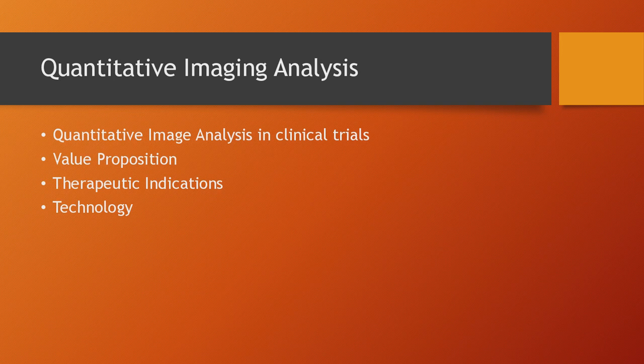So early treatment response changes are one of the indications for treatment response monitoring using imaging biomarkers, right? And also the evaluation, for example, of radiotherapy efficacy combined with chemotherapy is useful, right? Also treatments to stop brain degeneration or brain atrophy, and treatments for metabolic disorders like steatohepatitis. So the therapeutic indications that we are working with are mainly in 5 pillars.